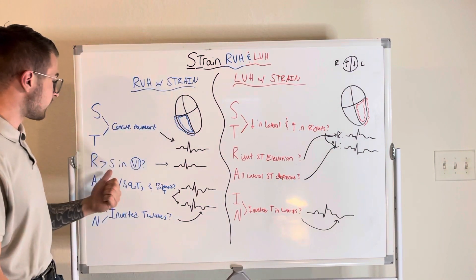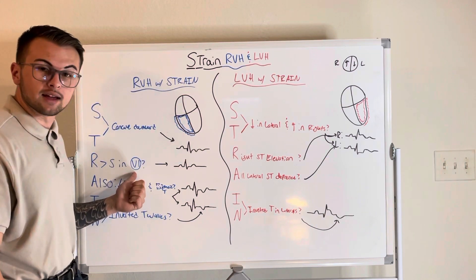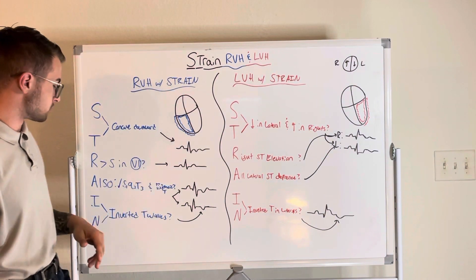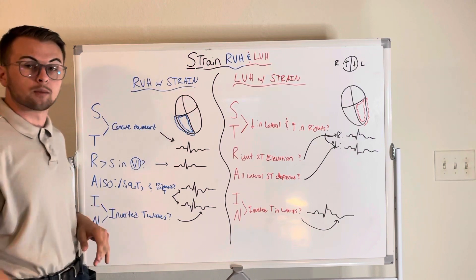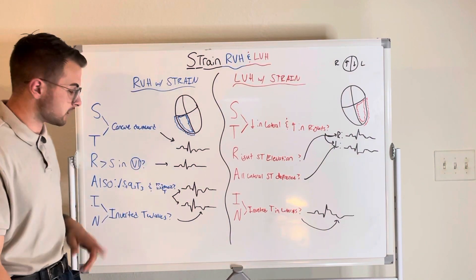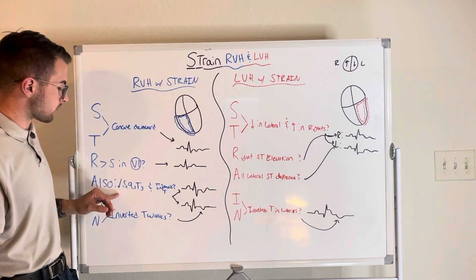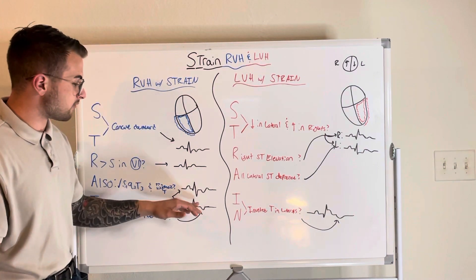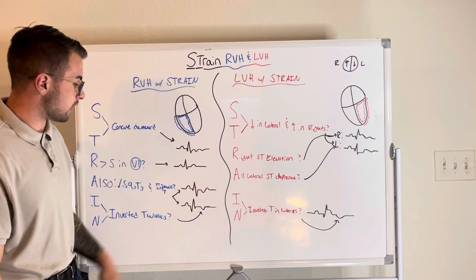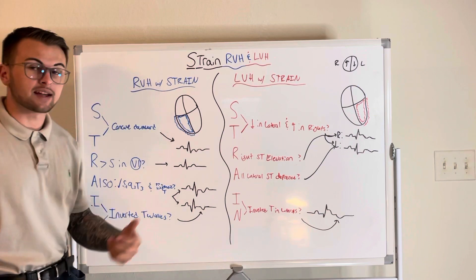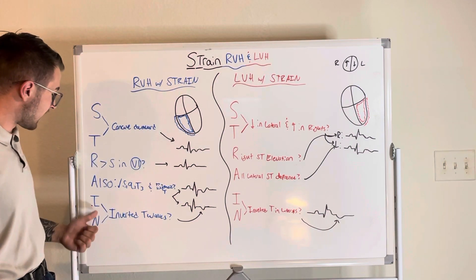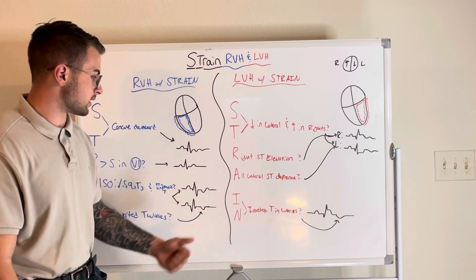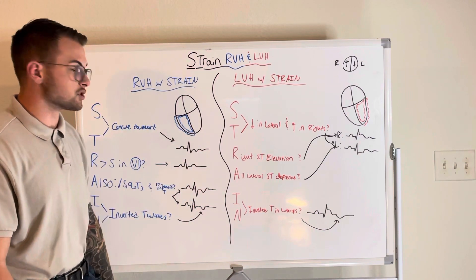An RS ratio greater than one in lead V1 will indicate right ventricular hypertrophy. Additionally, we need to check for an S1, Q3, T3 pattern or biphasic T waves as shown here — that can indicate strain. And then the IN stands for inverted T waves as we can see here.